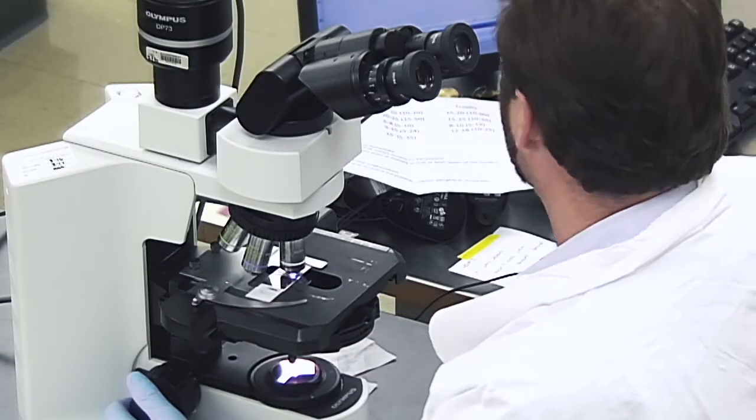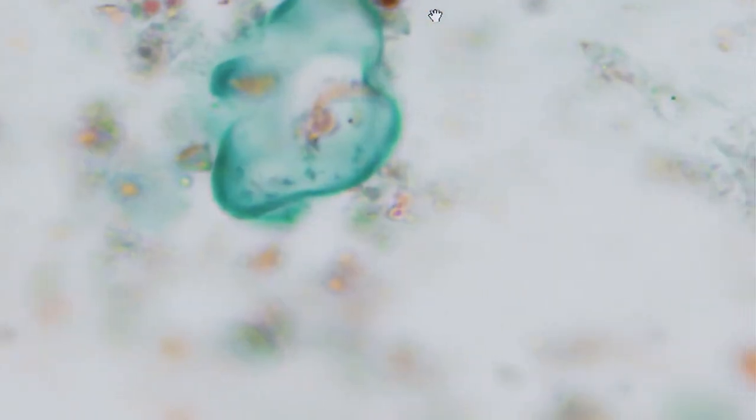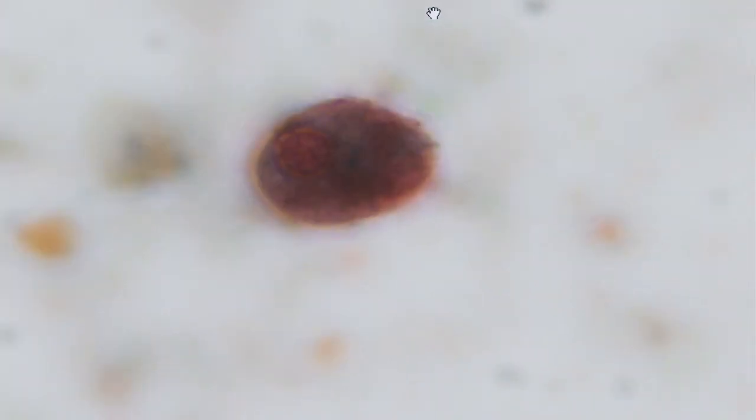Now, when I hear that, I immediately think of one particular organism, and that is Entamoeba polecki. So this is Entamoeba, correctly should be called Entamoeba polecki / chattoni, because we can't differentiate them, polecki in pigs, chattoni in monkeys. However, it's quite sufficient to report them as Entamoeba polecki-like, and that will be sufficient for people to understand what they're dealing with. Look at the size of that nucleus compared to what appears to be a trophozoite here.